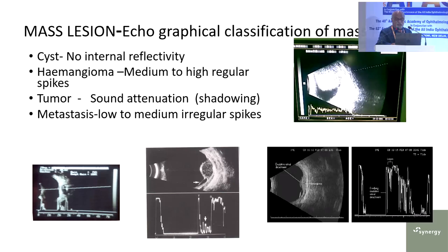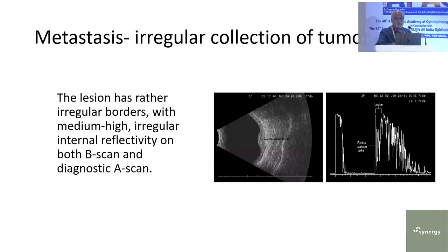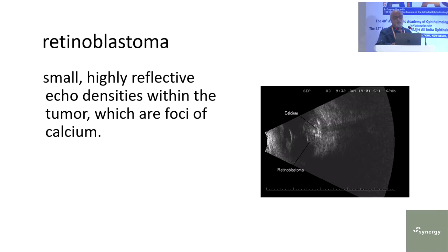And then finally, retinoblastoma, which you must always remember, because one of our very expert persons in a very big hospital missed a retinoblastoma at an early age and did not do any ultrasonography. A 2 crore compensation was asked for because the child became blind.